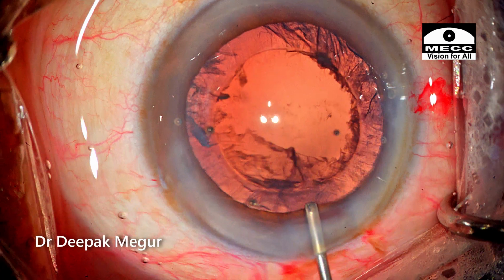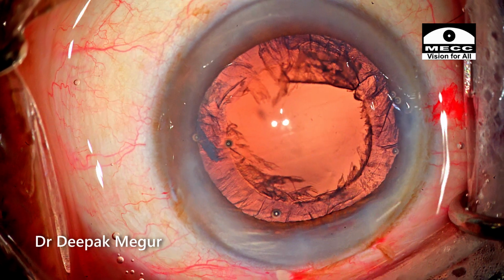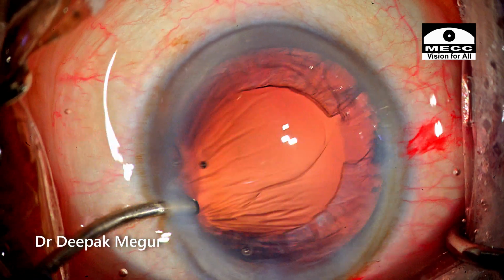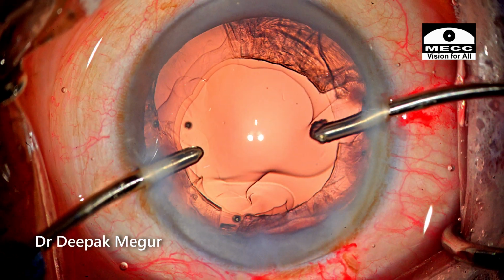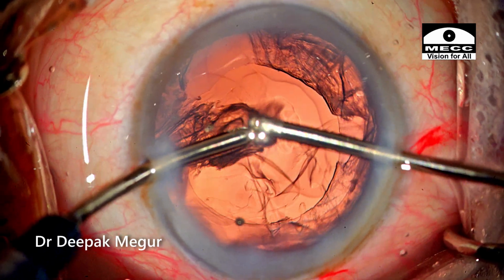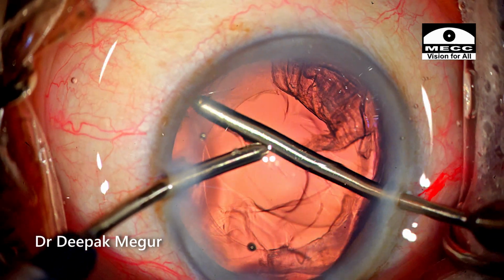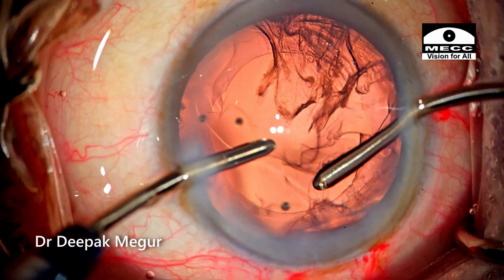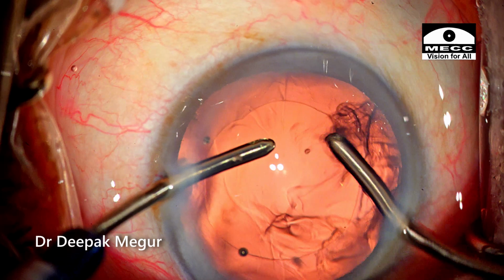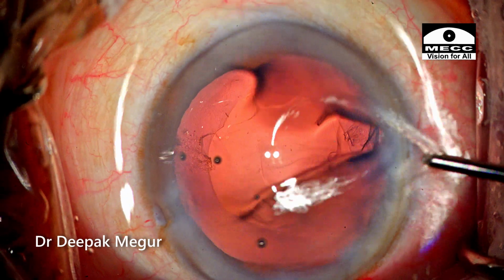I'm blowing the posterior capsule just to flush out any lens particles sticking onto it. Time to aspirate the cortex, and I typically use the bimanual IA system. You can see that as I'm trying to aspirate, the movement of the probe is tangential, horizontal. It's just ensuring that I'm trying to strip the cortex in a tangential fashion. This will ensure that even if we accidentally catch the anterior capsule, the zonular stress is minimized. So that's the idea of having this tangential movement.